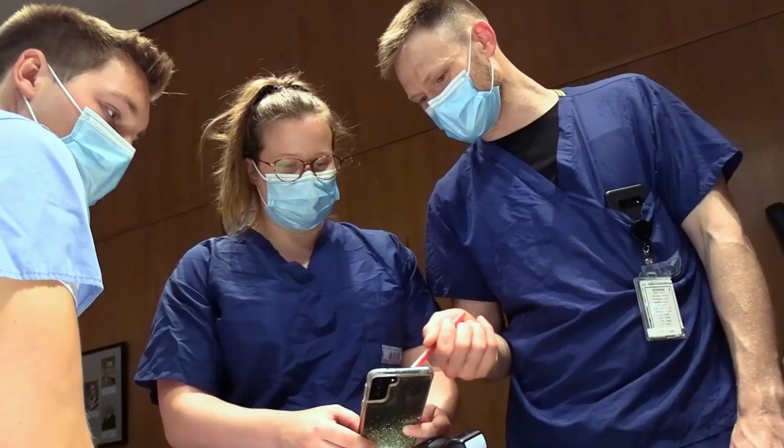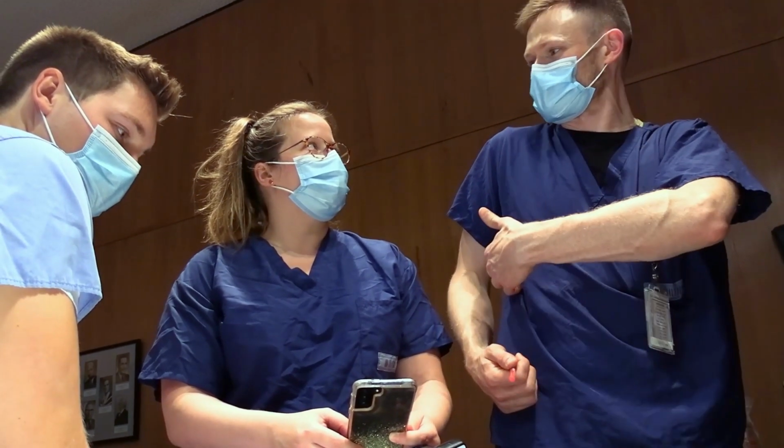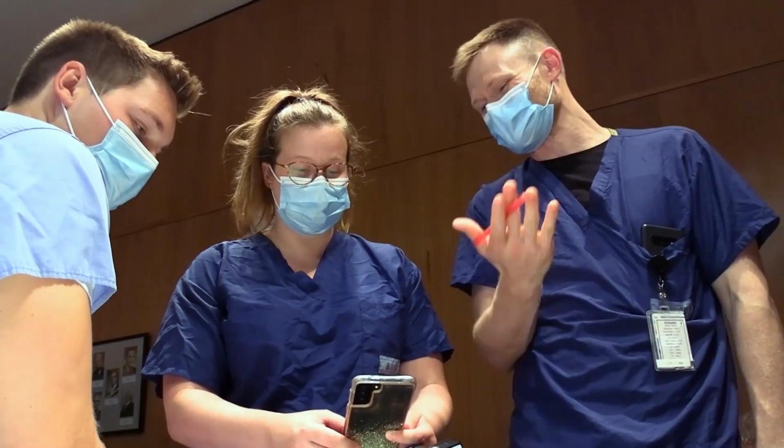Remember that one of the domains is clinical integration, so when the resident is done scanning, you'll want to debrief a bit and chat about the case. Make sure you know how the resident interpreted those images and ask them about the next steps in management.